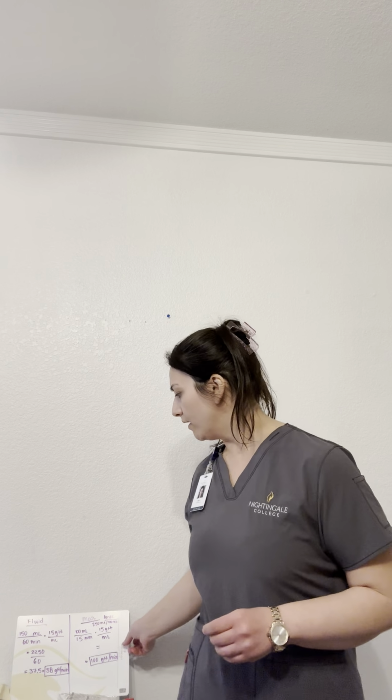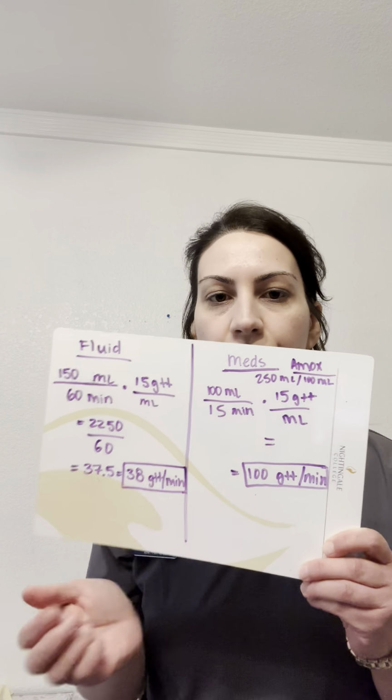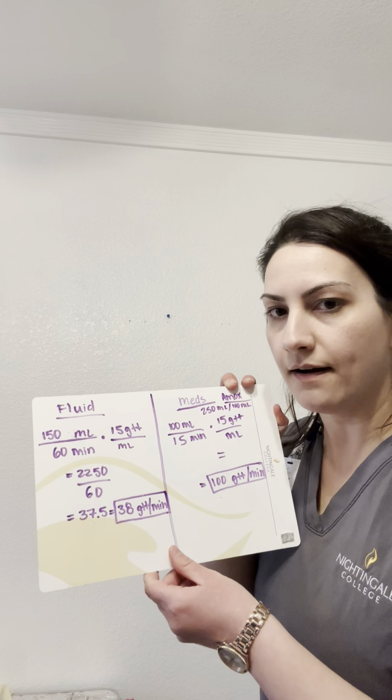I'm going to be performing the skills video of IV fluid and medication. Before I start off, I have all the work prepared here. We're going to give the patient fluid and then medication.